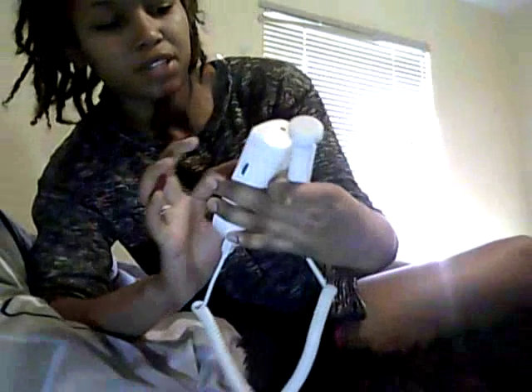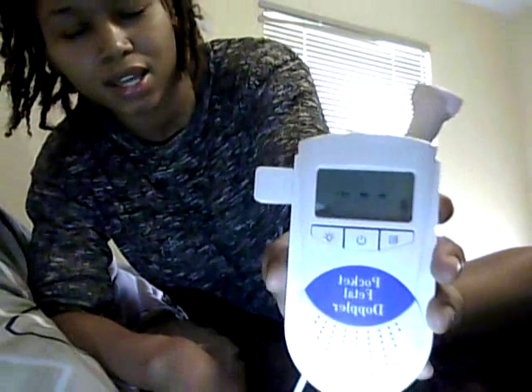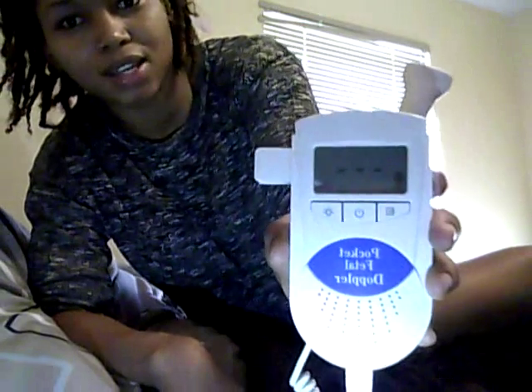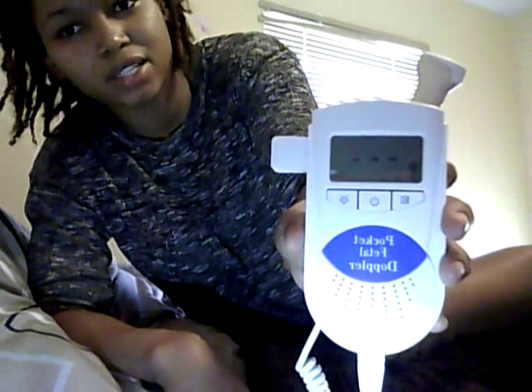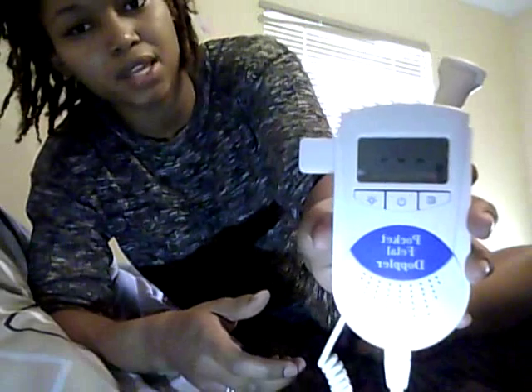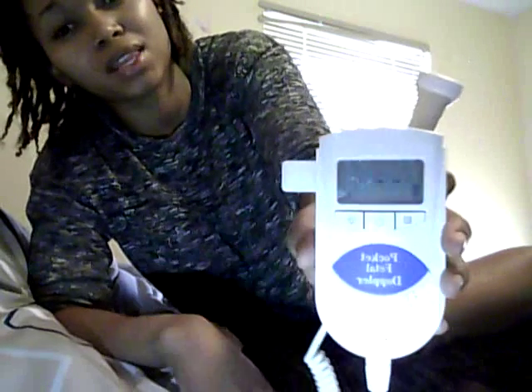Okay, and I'll turn the light on. So, right now... Oh no, maybe if I turn the light off, you can see it. Right now, it's like this. It has those dotted lines, those dashed lines. And that's when there is no signal, when it's not picking up anything. But you'll be able to see, once I place it on my stomach, the heartbeat, the numbers from the baby's heartbeat going up. And so I'll just leave that off right now. Okay.